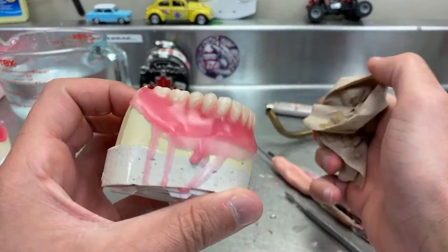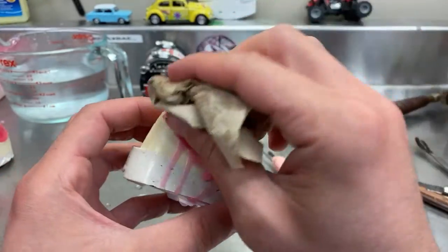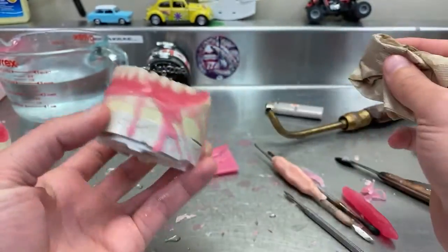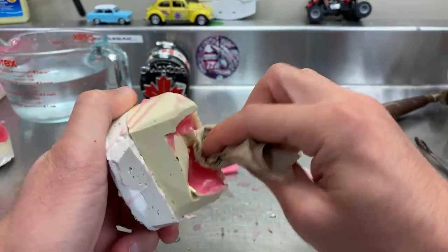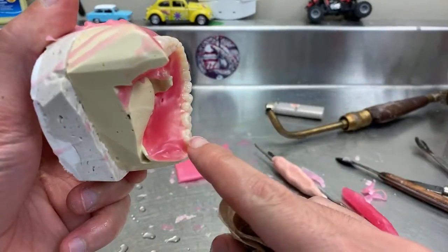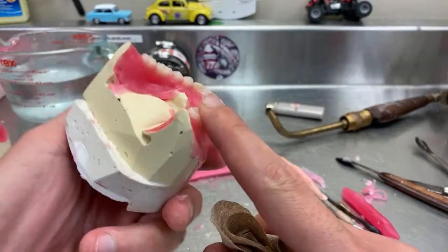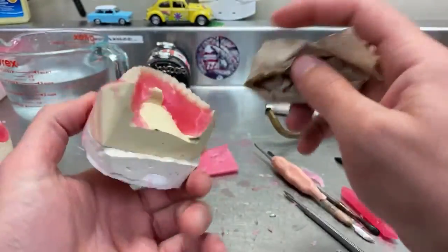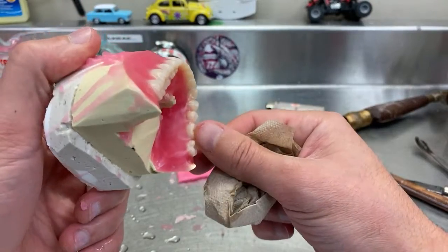Look at that. Because as I said, we flamed it nice. So when you actually wipe it, you don't even need secret sauce. Look at that here. I don't like it. But I won't be spending too much time. I would add more wax to cover the end of the tooth, as I can see it.